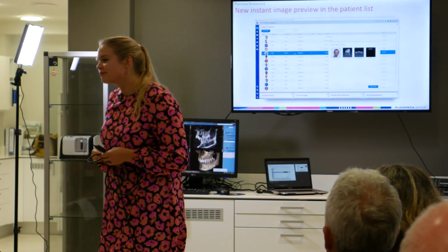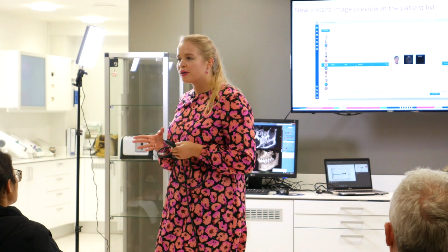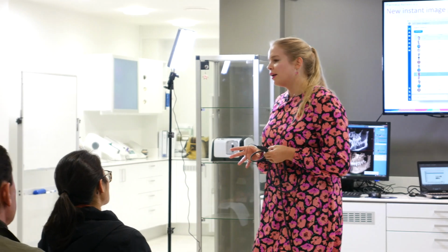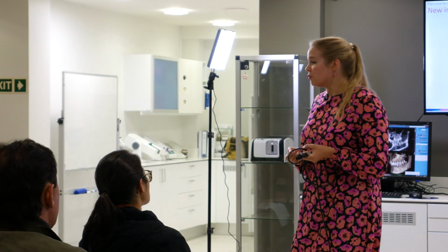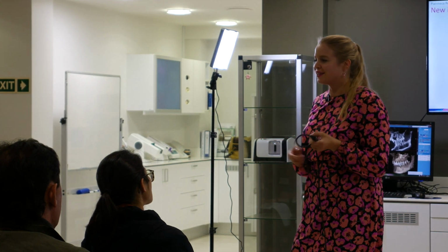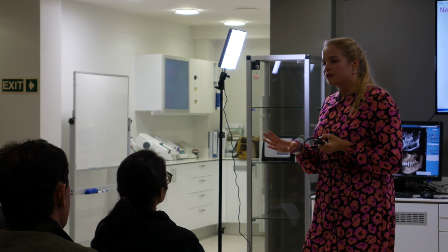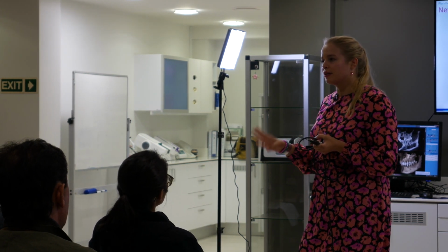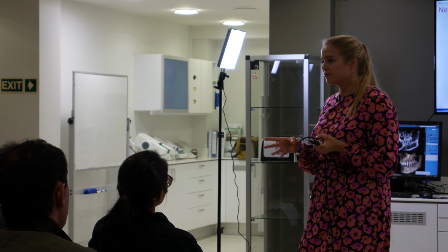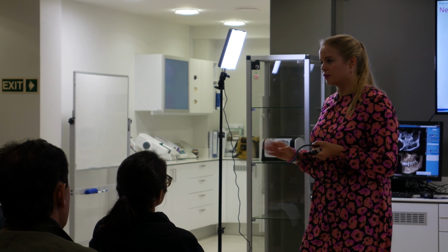I mean, what's the system requirement? The mobile imaging application that runs on iPad and Android tablet, and well, I don't know. I guess if it's not a very old tablet, I think it could. The application you can get from App Store if it's iPad, and from Google Play Store if it's Android tablet, and I guess if it's available there, you can just download.